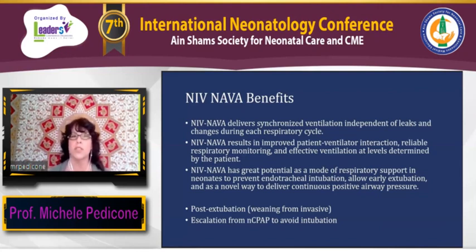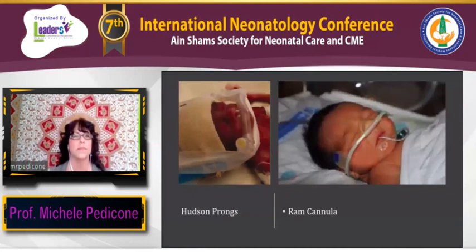So when we have switched patients to the non-invasive NAVA from CPAP, they have been supported better and have been more successful. This can also help when you're extubating a patient, when you're weaning; this can be a step down. You can go from invasive NAVA to non-invasive NAVA because you're using the same machine. The catheter is already indwelling in the patient, reading the signals, and you just switch them over.